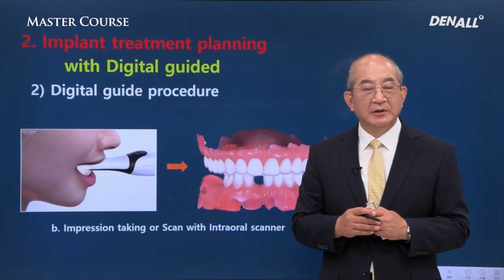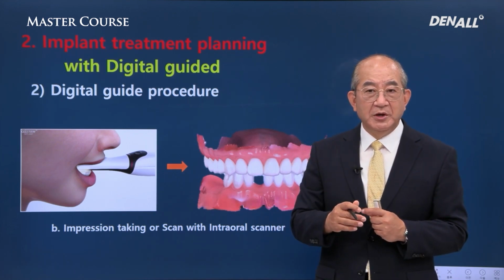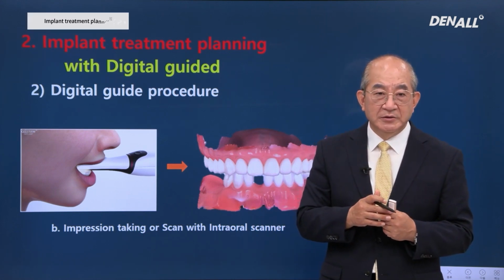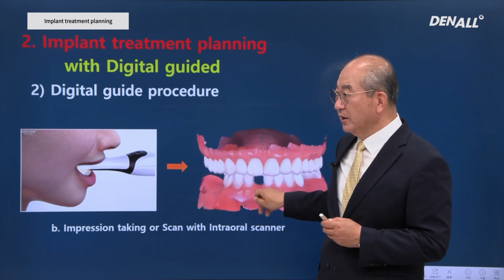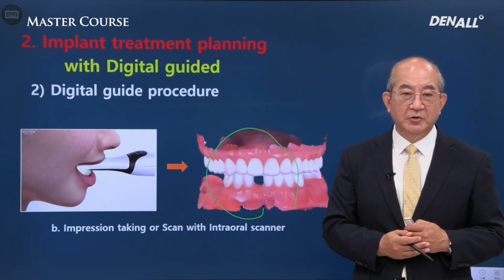Second, the traditional analog way without intraoral scanner, you would have to use impression material and make model. If you have intraoral scanner, as shown on the image, you can extract the surface data.